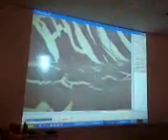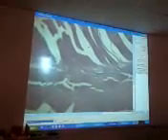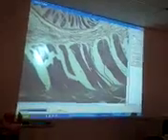And then this is kind of an unusual angle they made this cut at. So you're actually seeing the circular layer looking kind of irregular, which is this is the circular layer here. And I go a little further out, and this is actually the long layer out here. So the layer that on this one at least looks like it's circular is actually the long. Let me give this heading. See out here, all this is the long layer, all this is the circular layer, it's the smooth muscle.